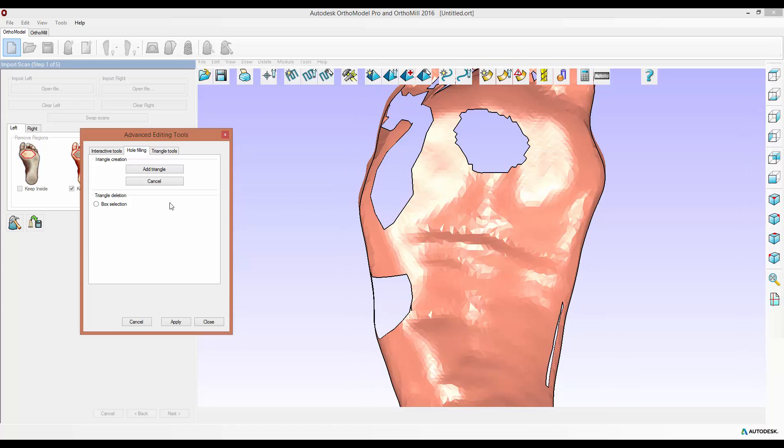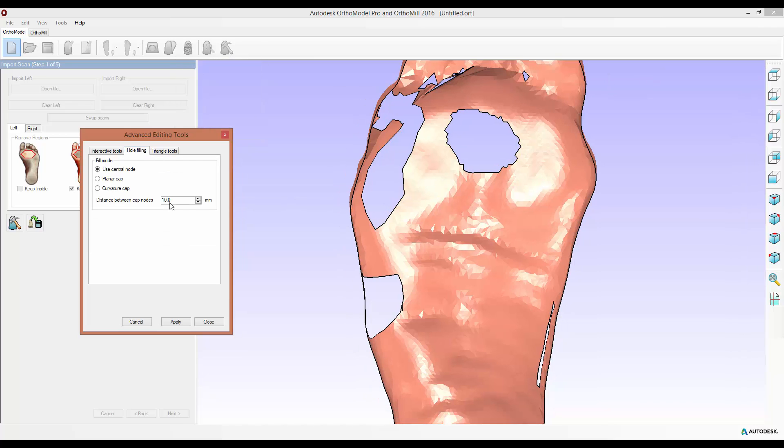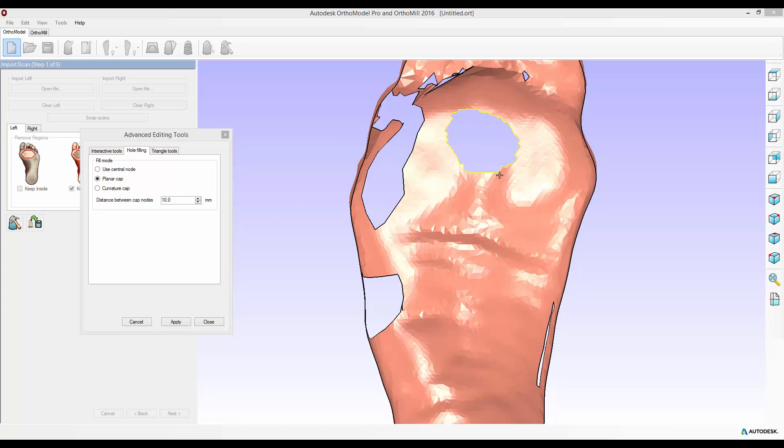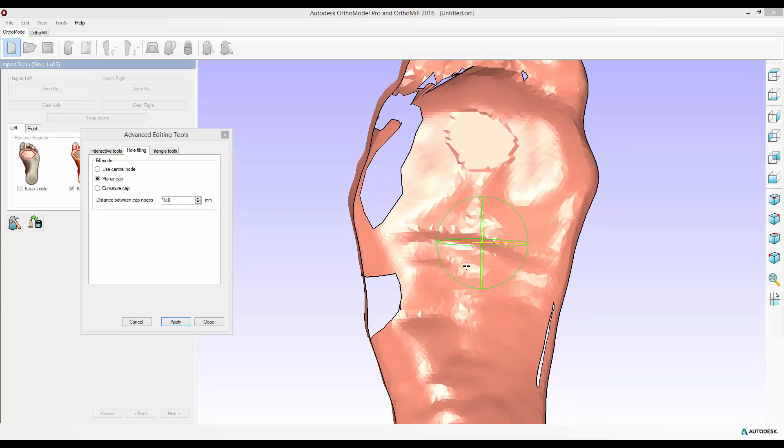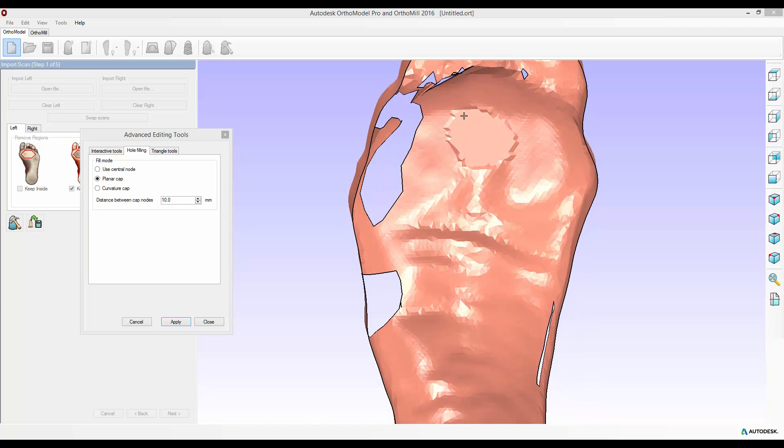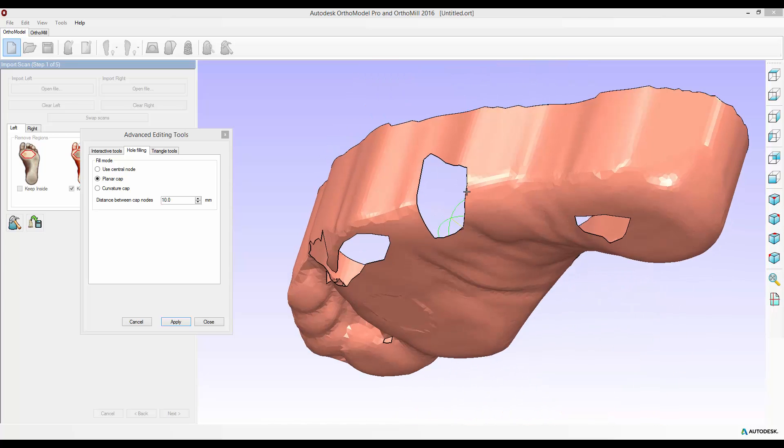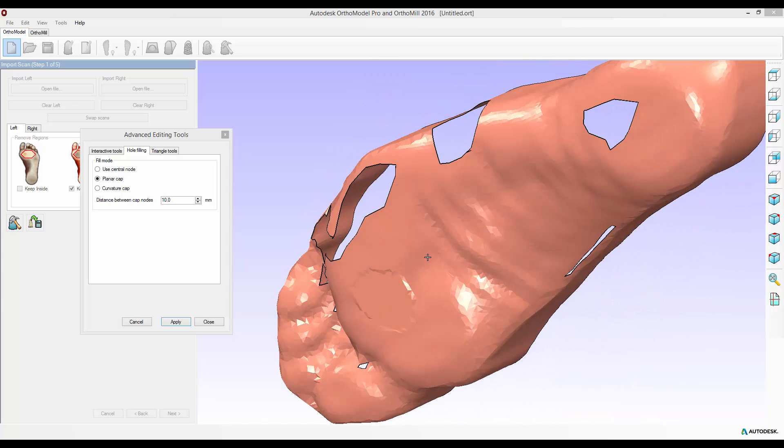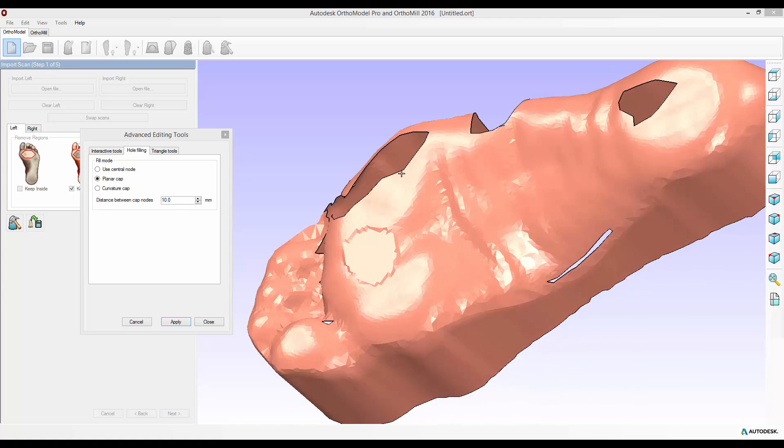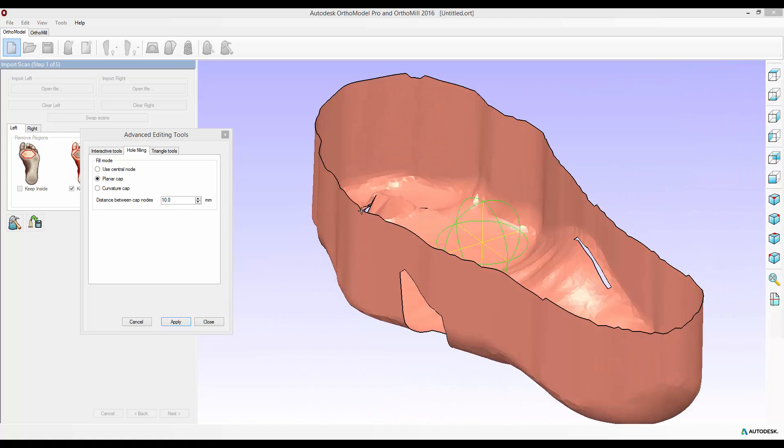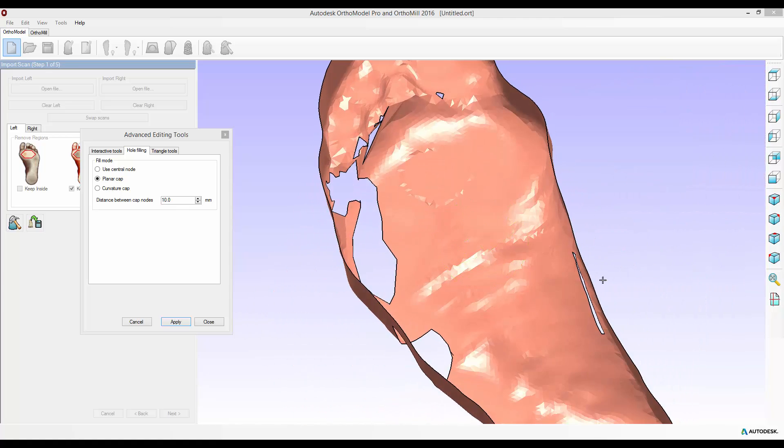Back in the hole filling tab, the planar cap mode allows much cleaner filling of holes on flatter surfaces. With that selected I can select my boundary again, select apply. The fill in general is much smoother, it's just around the edges where it's a little bit rougher. This is because this method selects the plane of best fit within the boundary and then uses triangles at the edge to merge that plane in with the rest of the scan. Looking at it more closely it's not too much of a deviation, it might be good enough for a selected purpose.